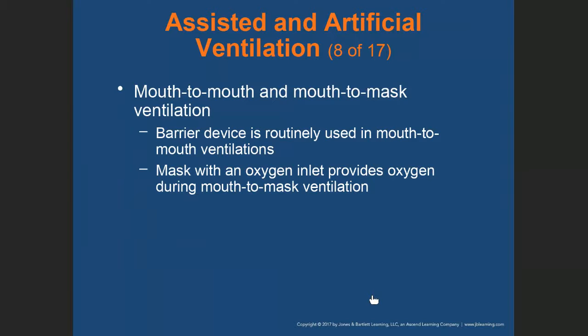So if you're having trouble with your BVM, go back to your pocket mask, because you can use two hands to maintain a seal with your pocket mask and breathe for the patient. Let me repeat, all of you need to have a pocket mask when you come to your face-to-face session. Start investing in one. Do not turn up and tell me that you don't have any, because I can't grade you if you don't have it. I need to see everybody use a pocket mask and make the chest rise.